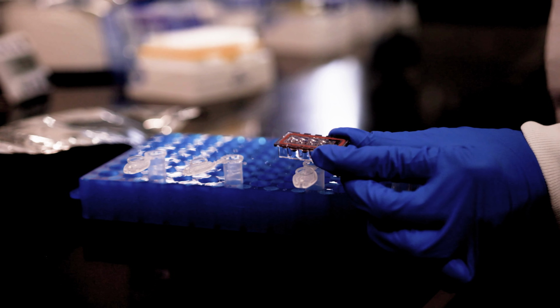What we call accessioning. We'll extract those samples or aliquot them out so that each test that needs to be performed on a spot can be done. We'll run the test that's required, and then we'll get the results and report them out.